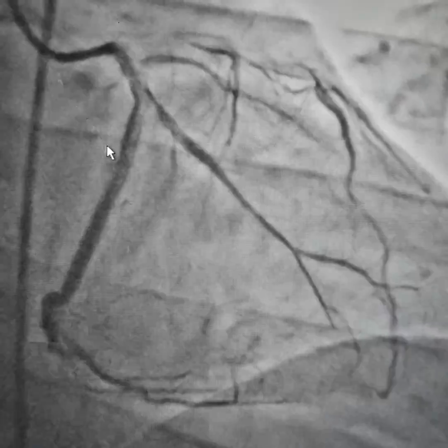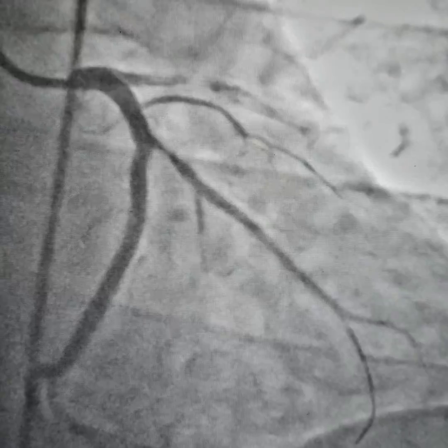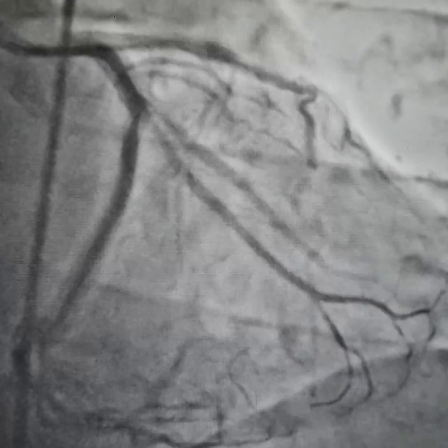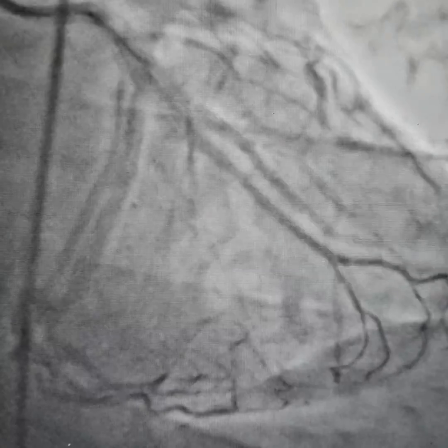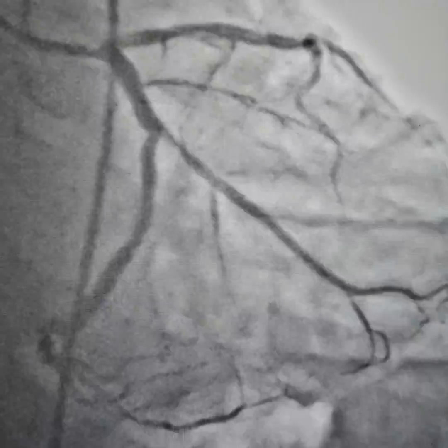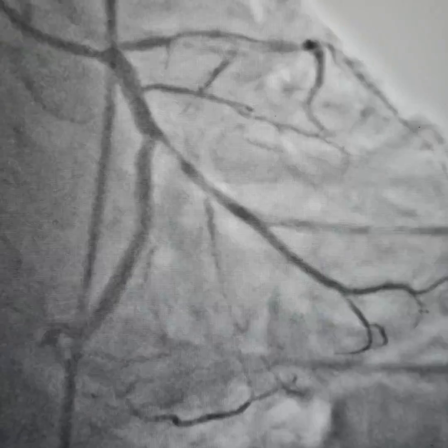We can see that the obtuse marginal has started opening. We pre-dilated some more — so it's good. The patient is pain-free at this point in time. We used the femoral access; we generally use the femoral access in cases of an acute setting.